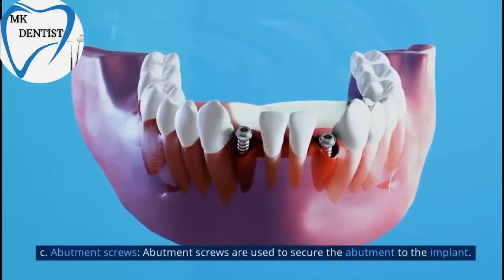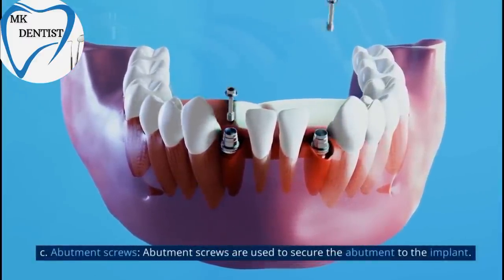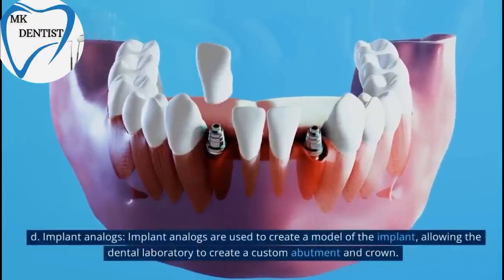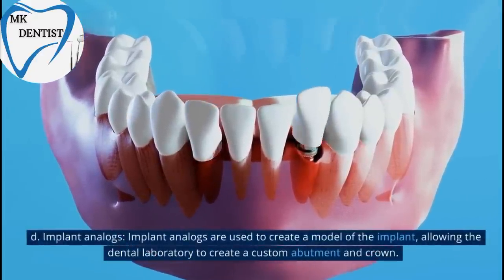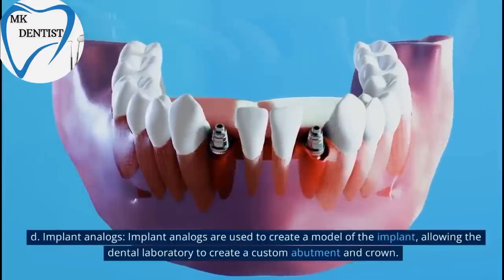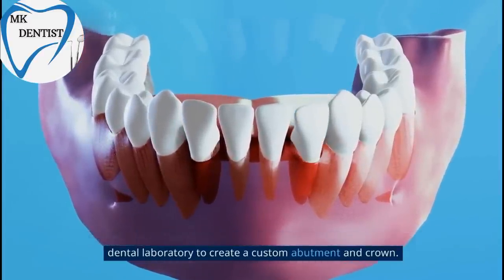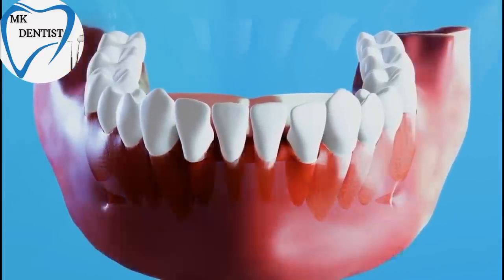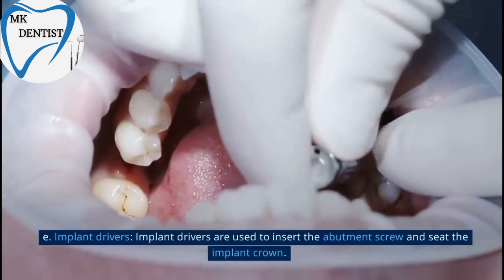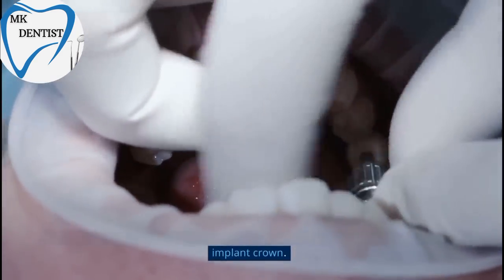C. Abutment Screws. Abutment Screws are used to secure the abutment to the implant. D. Implant Analogs. Implant Analogs are used to create a model of the implant, allowing the dental laboratory to create a custom abutment and crown. E. Implant Drivers. Implant Drivers are used to insert the abutment screw and seat the implant crown.